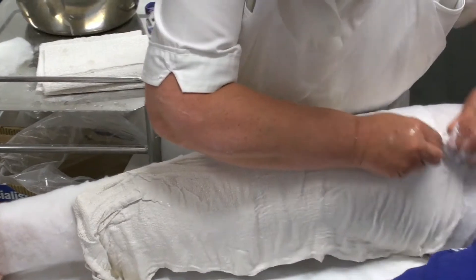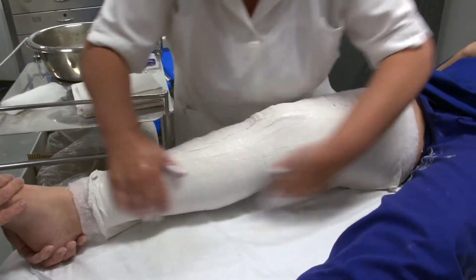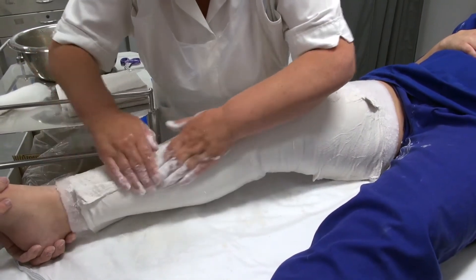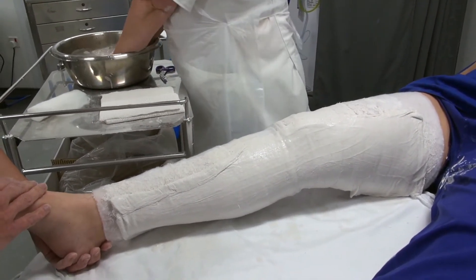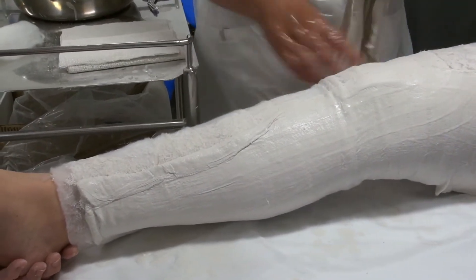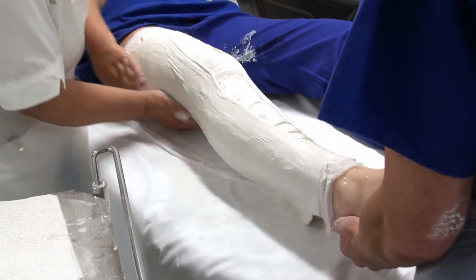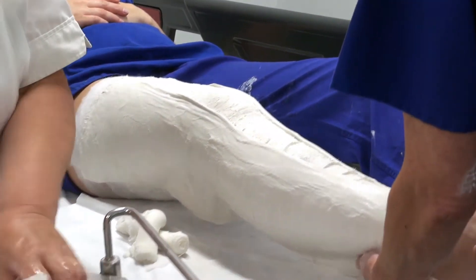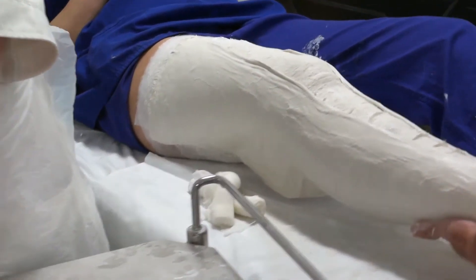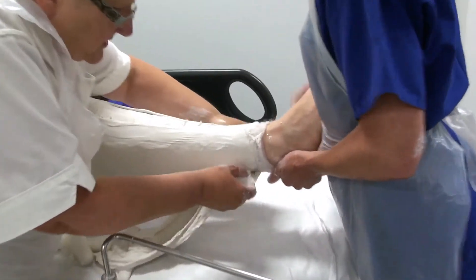I'm starting off with the side slabs, doing the inner one first. You can just hold the bottom one for me there.